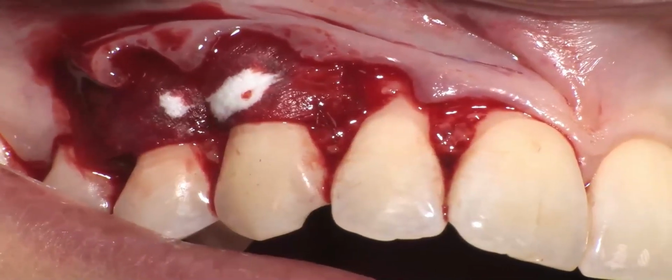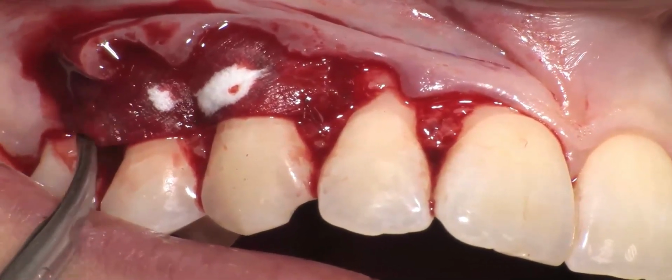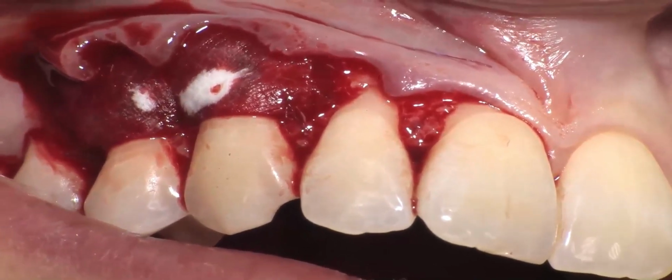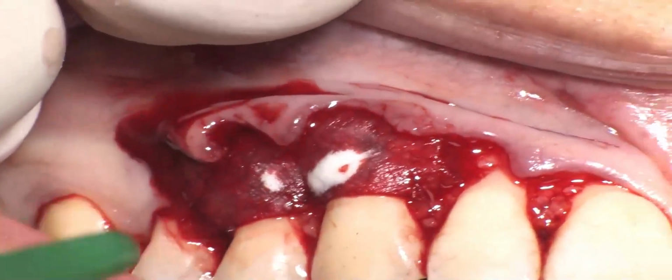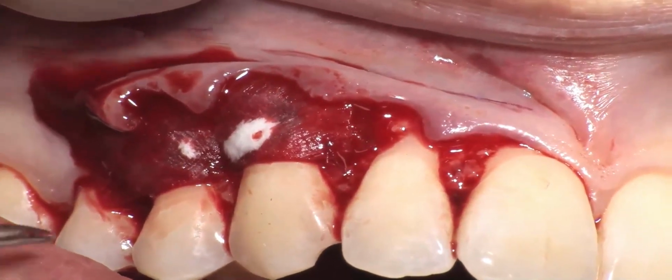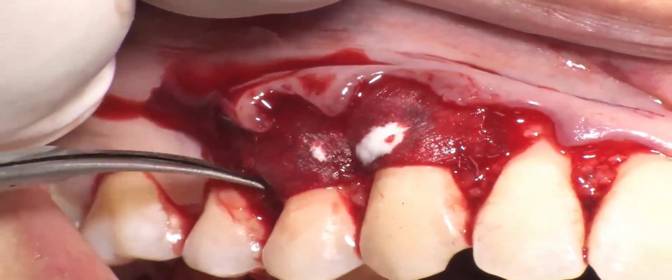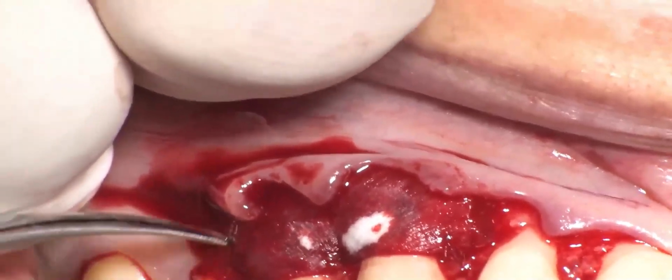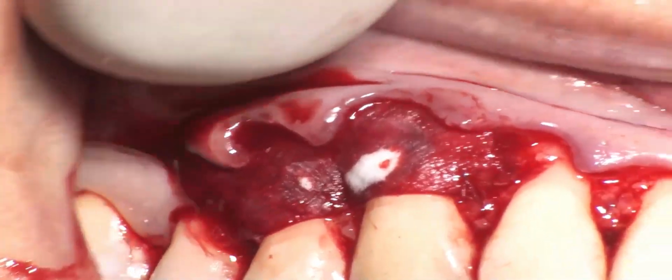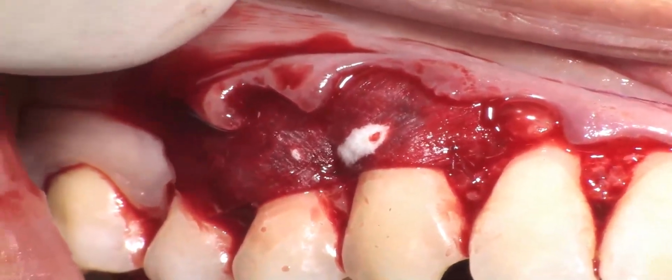Now I have to suture the last area of the material to the base of the last papilla. It's very difficult in this area because the papilla is bleeding a bit, but bleeding is something that I like with this material because obviously I need blood.